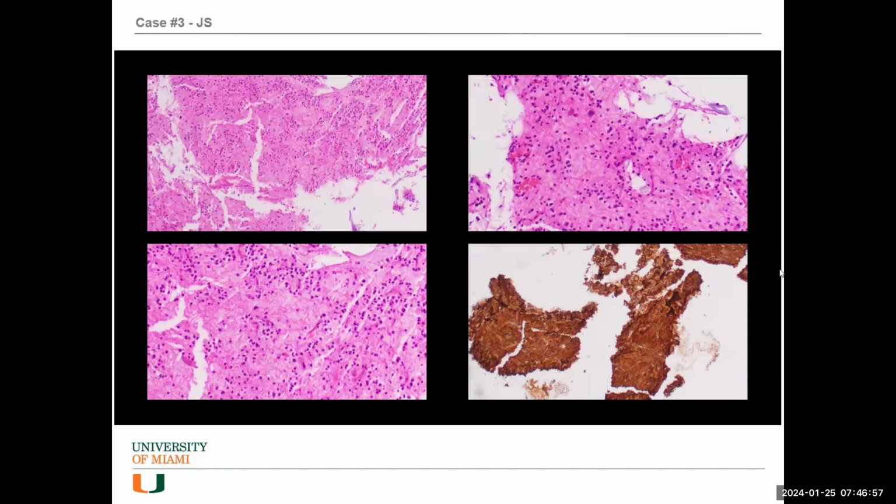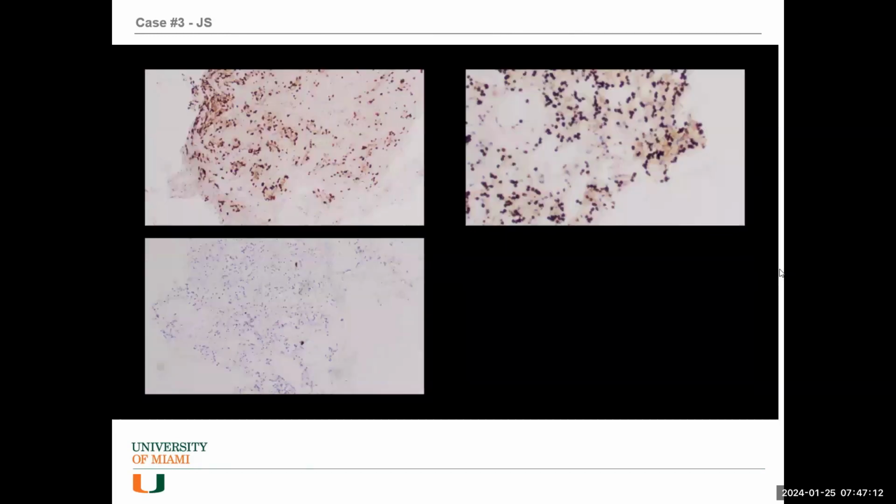And we were very careful not to do too much immunohistochemistry here, because we thought that we had a diagnosis, but we need to send NGS. So it's GFAP positive. Do we have another slide? We do, yes. Here you can see with OLIG2 on the left upper picture and right upper picture the distinct rosette-ish structures. See those round little rings of cellularity? That's very typical, and these would be synaptophysin positive if we did it. We didn't do it deliberately. To make a long story short, after obtaining the Ki-67 index, very low, less than 1%, and with these morphological features, we thought that this is an example of a rosette-forming glioneuronal tumor.